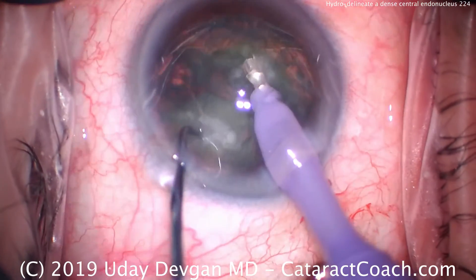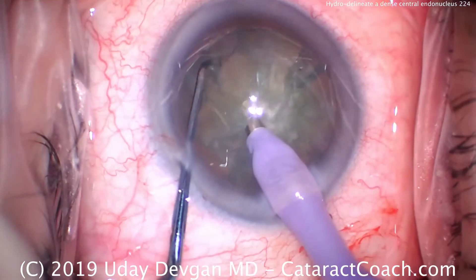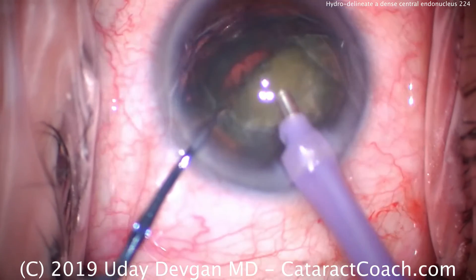Notice we didn't have to pass the chopper around to the equator of the nucleus — we just passed it around that endonuclear piece. Another chop and we can remove the endonuclear pieces now.